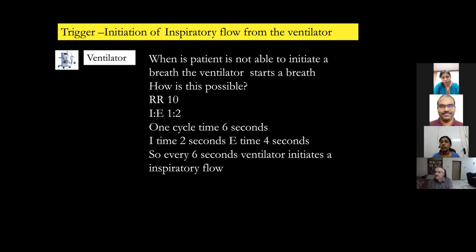So that means every 6 seconds, the ventilator knows that it has to start a breath. How does it know? By elapse of what? Time. So how does the ventilator know to start a breath? It's always by the elapse of time.